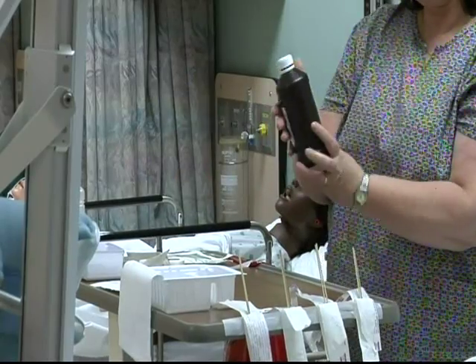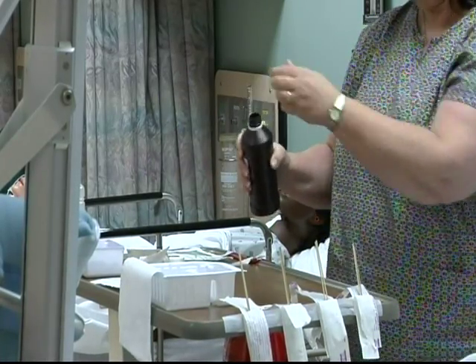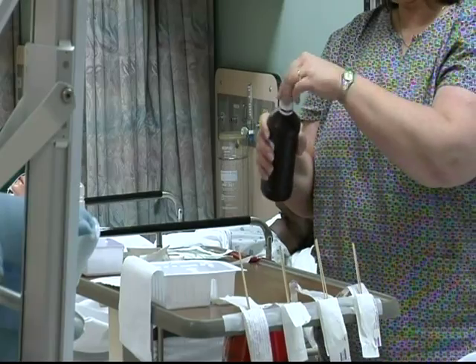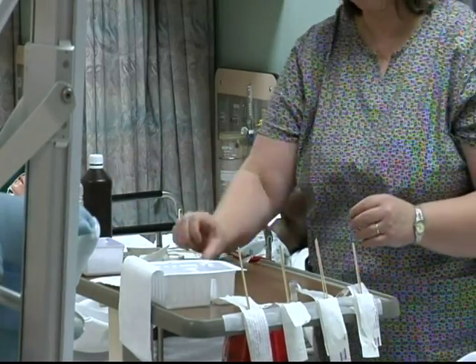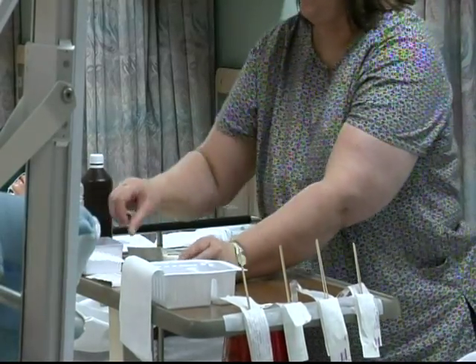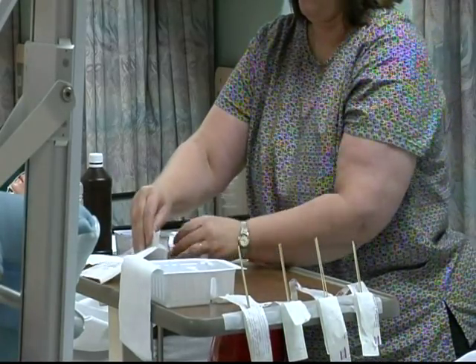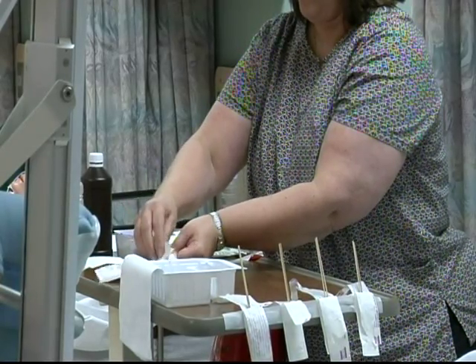Then take your peroxide, label to palm, lip it, pour a little bit in the front tray. Then make sure that you date, time, and initial your bottles so they'll know when they were opened. Then take your inner cannula, open it. Then take your drain sponge, open it also.